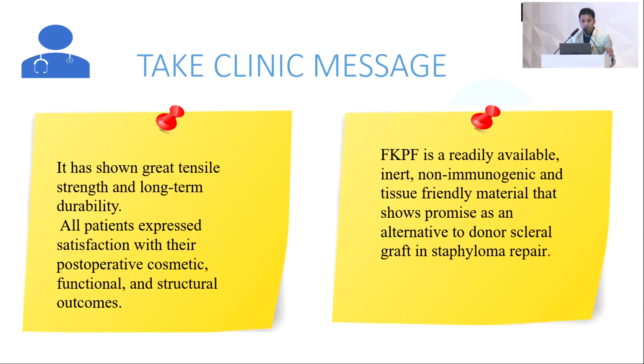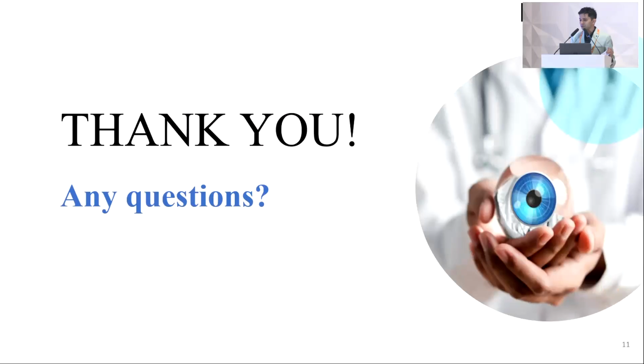The take-home message is that the filamentous polyester fabric has shown great tensile strength and long-term durability. All the patients have expressed their satisfaction with their postoperative cosmetic, functional, and structural outcomes. And the material is readily available, non-immunogenic, and shows great promise as an alternative to donor scleral graft in staphyloma repair. Thank you.